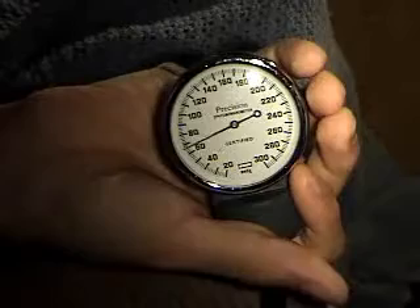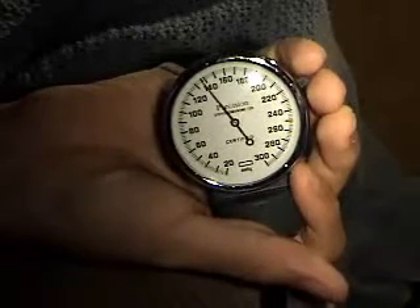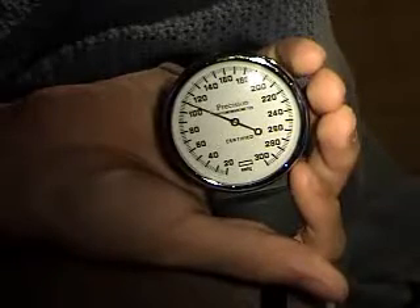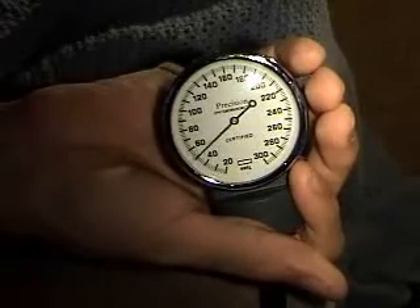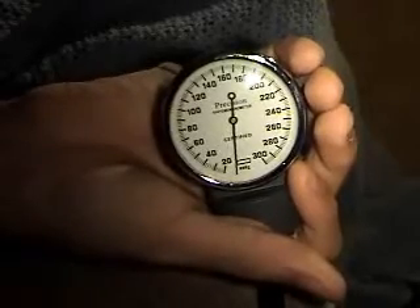Now you're going to start inflating the cuff — inflate it slowly. You're going to go 30 over the last time you heard the pulse, then deflate it slowly. The first bump you hear is going to be your systolic number — that's your top number. The last bump you hear is going to be your diastolic number.